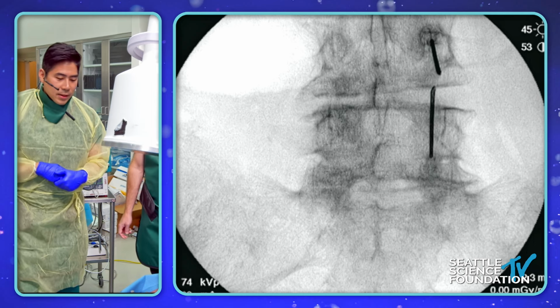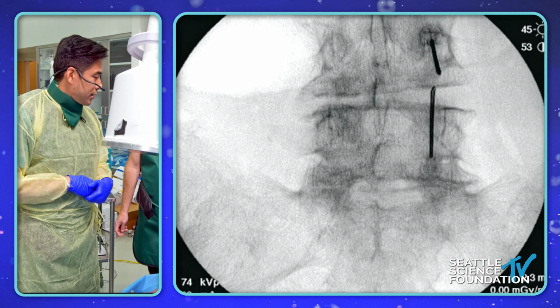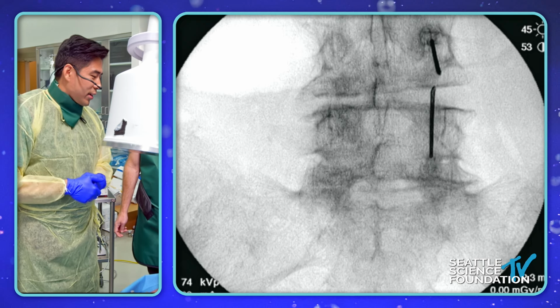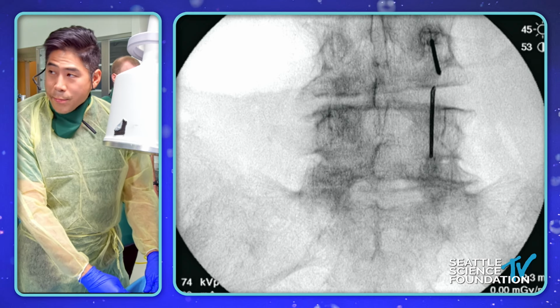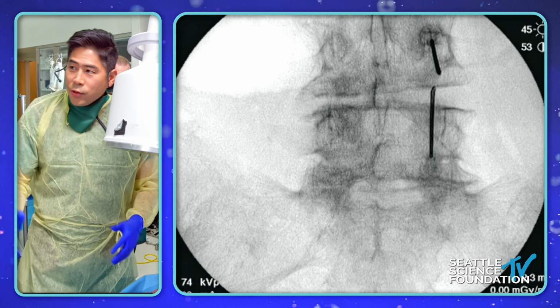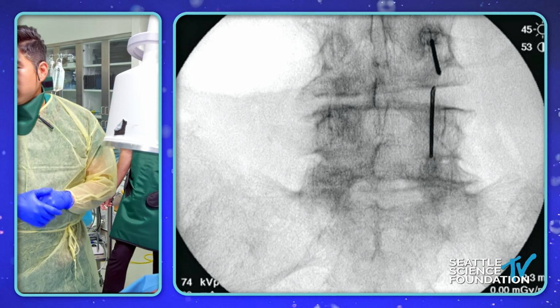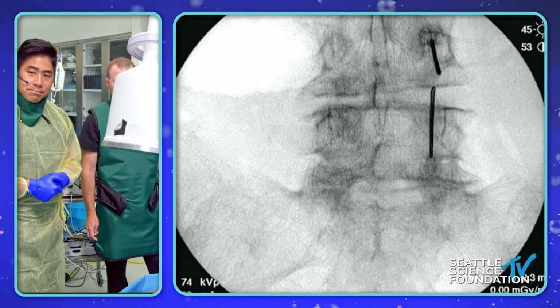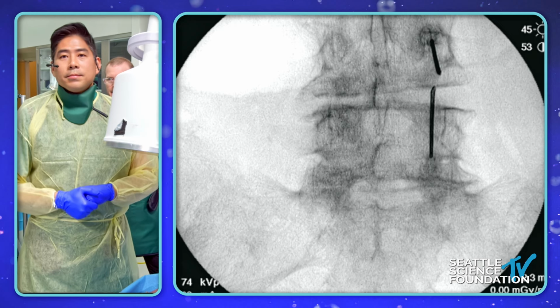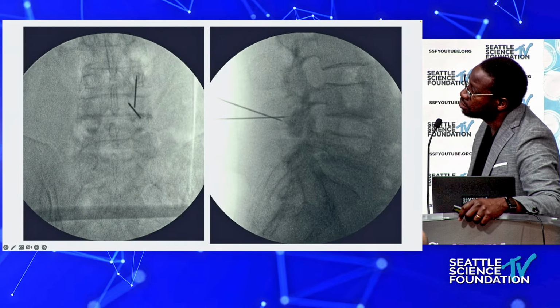Okay, we can't see a lateral, huh? Okay. Well, basically on the lateral picture, you want to see these two needles sort of on top of the facet joint. So let's go over to the presentation. I think we have an example of what you were trying to explain.